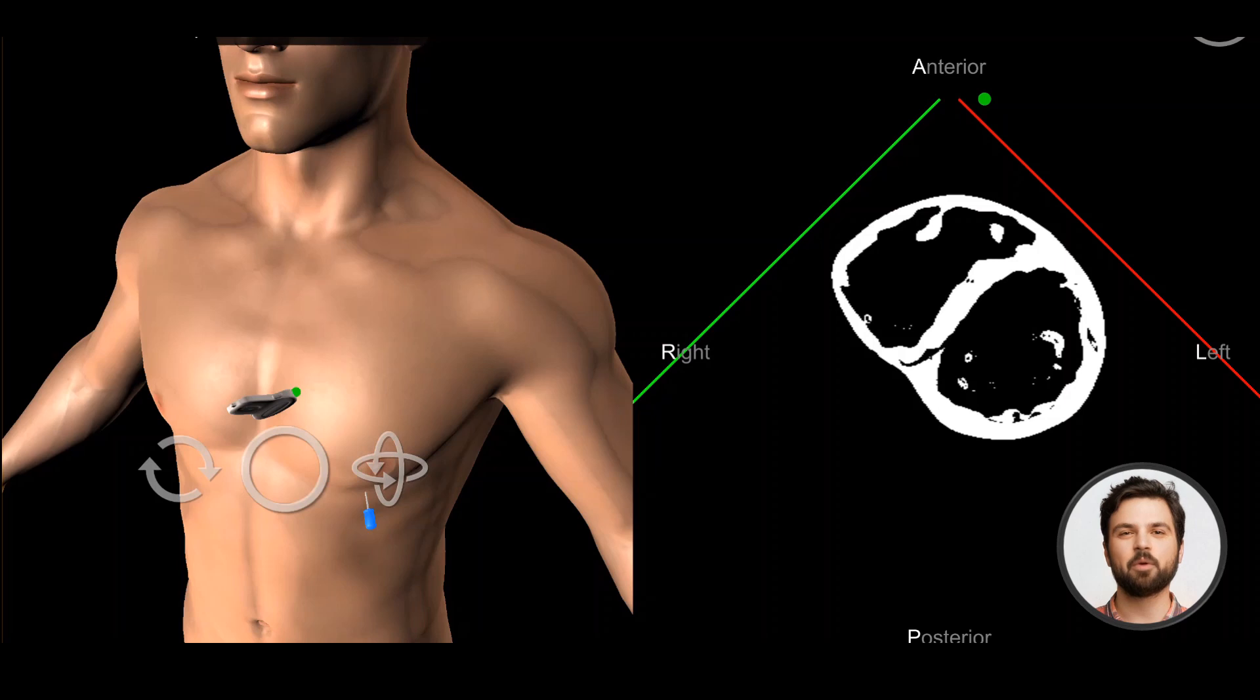Let's look at the apical 4 chamber view. The patient is positioned as before in the left lateral decubitus position.